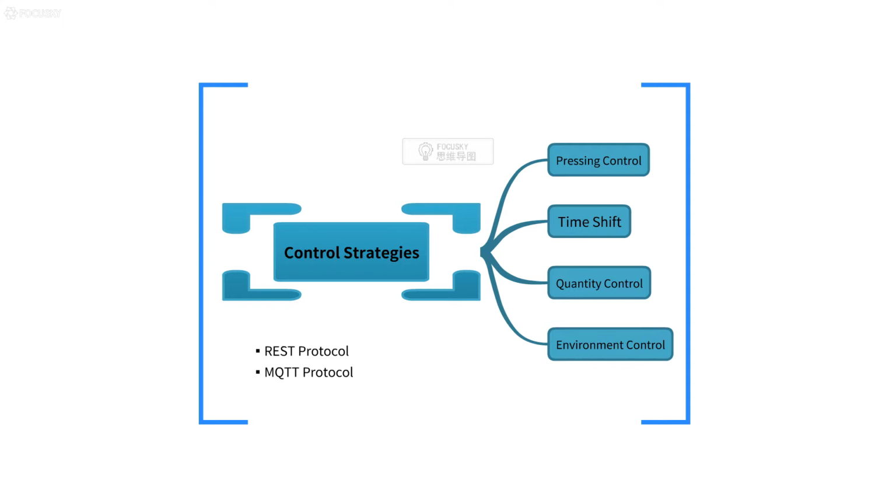If we press the button, it checks if the current user needs to take medicine at this time. If yes, it will publish control commands to LCD screen and LED lights. LED lights of the corresponding places will be turned on, and the remaining quantity of these medicines will be computed. In catalog server, the quantity information will be updated through post service. If some medicines will be finished, user will receive a notification email.